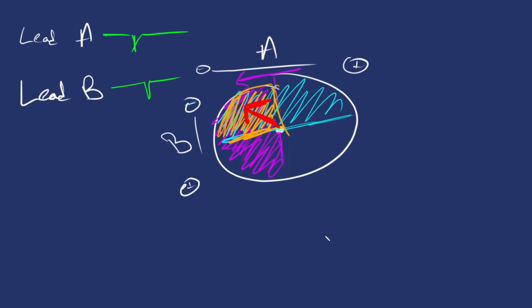So this, again, is an important concept. We'll go over it a bit more in depth. If you understand this, you understand already how to read an EKG. And maybe if you've done some kind of EKG or rhythm interpretation, certain things are probably starting to click as to why, when you look at something that says lead 1, lead 2, lead 3, those look different even though we're looking at the same heart.